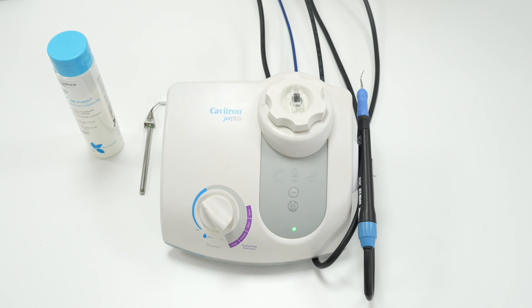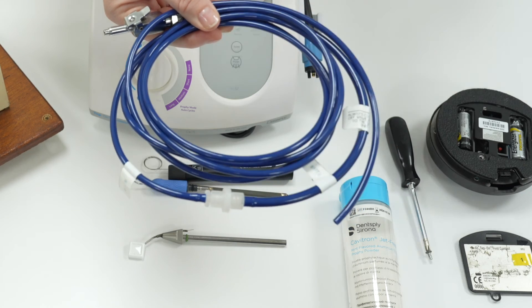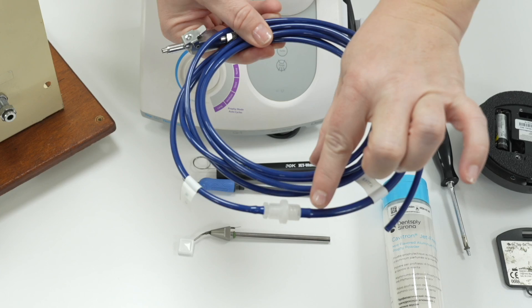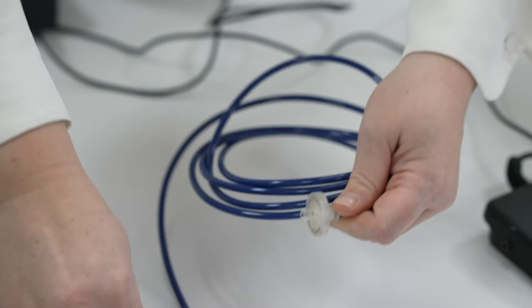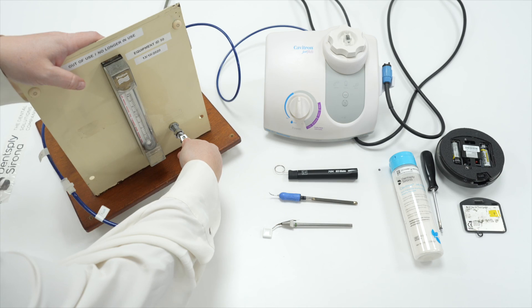To begin with, look at the filter along the water line and change it if you see any discolouration or debris. Unplug the water line at the ADEC connection and unscrew the filter and screw into place a new filter and then plug the water line back into the ADEC connection.